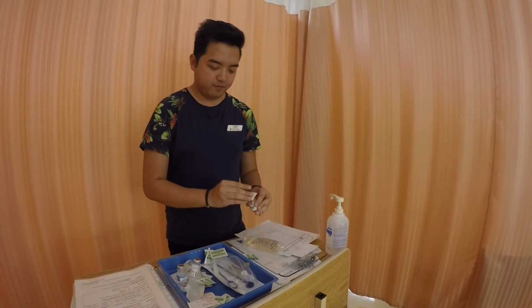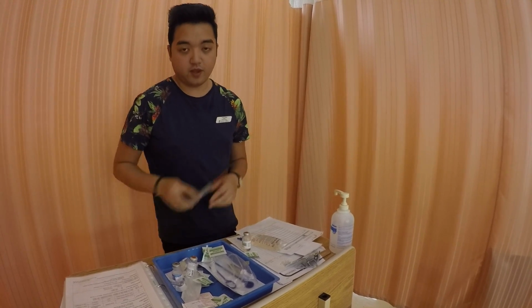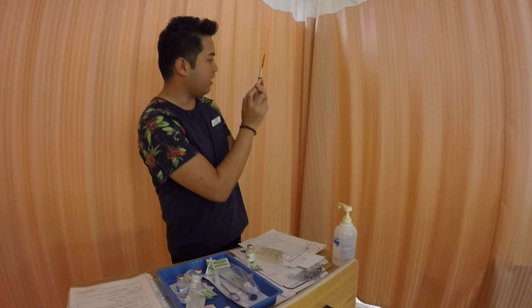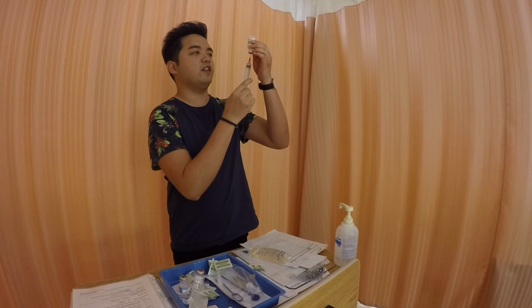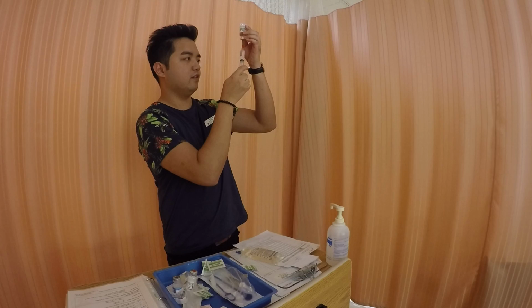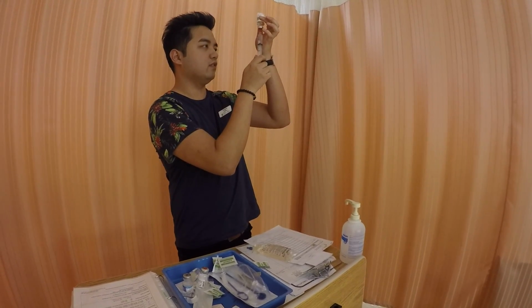So let's swab for 30 seconds. Let it dry for 15. We withdraw 5.8 in the syringe of air. Okay, there you go. Inject. And then get 5.8. Okay, make sure there's no bubbles. Okay.